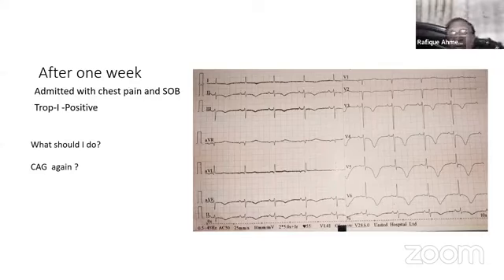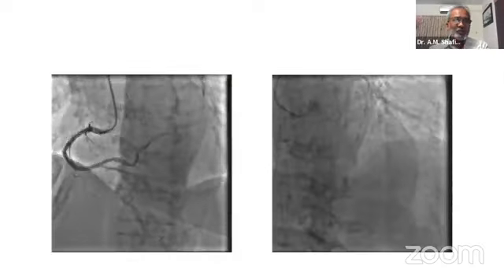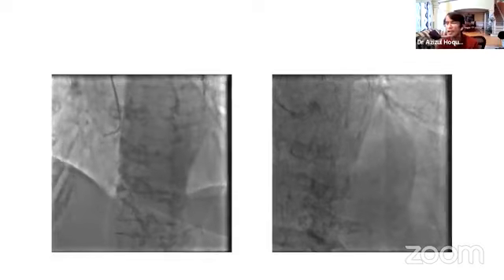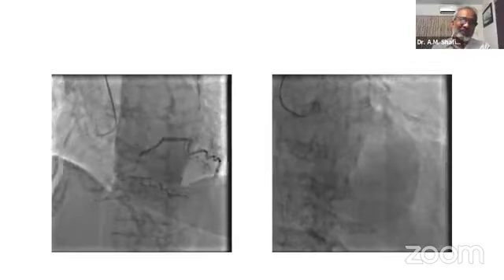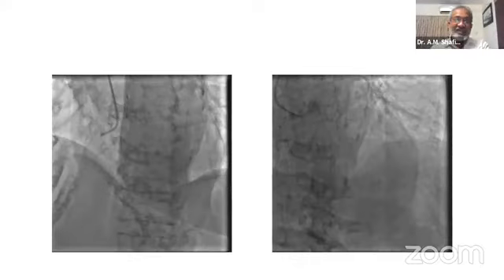Mm-hmm. So let's see what you found. Myocarditis. Myocarditis led to atrial flutter as well as T inversion. QT is prolonged. That is why I did the electrolyte and magnesium levels, and they are also normal. What was her blood count? I found the blood count is normal. Okay. And then I decided to do an angiogram, but still it is normal. So I could not get it. Now, can I see the LV gram on this patient? No, I did not do the LV gram. Okay. The echo was normal, and I did the echo myself, and the echo is normal with a restrictive pattern of diastolic dysfunction.